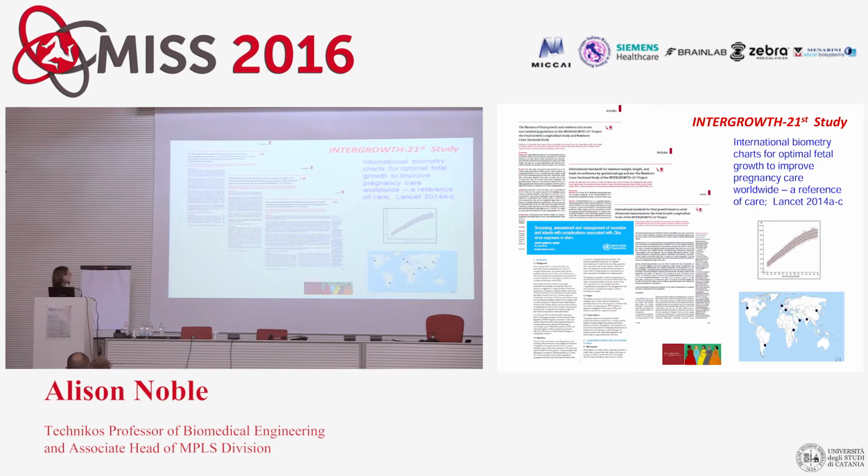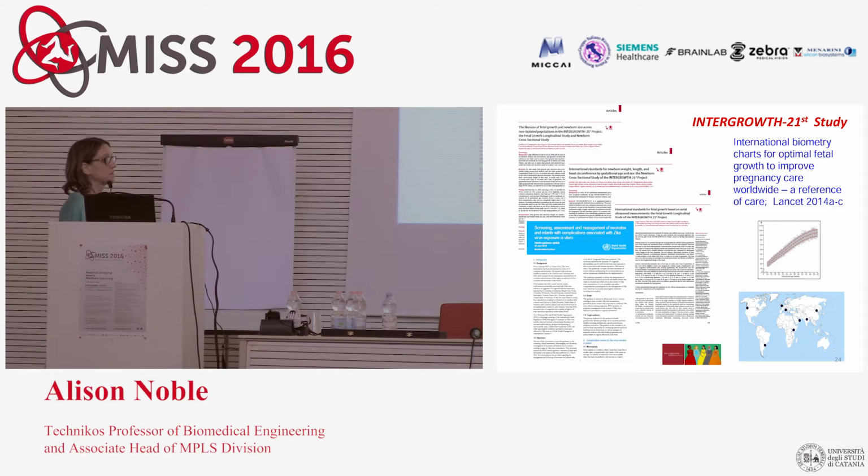What was special for me about being associated with this project is that I had the opportunity to talk with people from around the world about what the real problems were in their area, and also to understand a lot more about the ultrasound data, which I'll come on to in a minute. But this project has been quite influential. Last month, for example, with the Zika virus, the charts they've derived for head circumferences for neonates are now being adopted in Brazil under the recommendation of the World Health Organization.